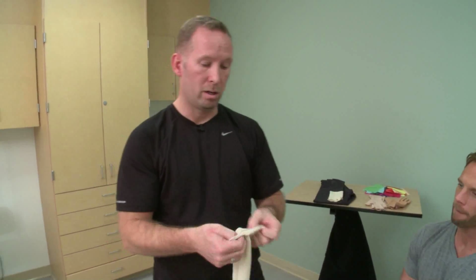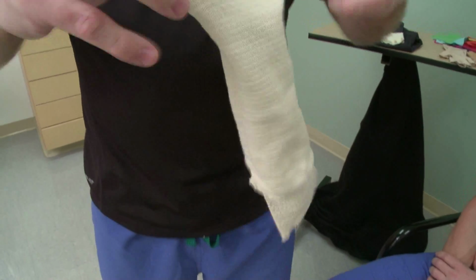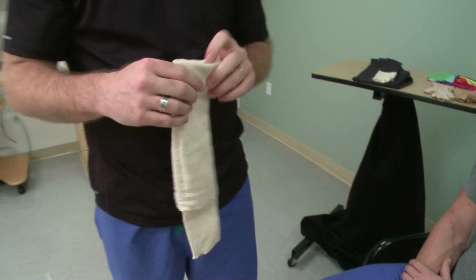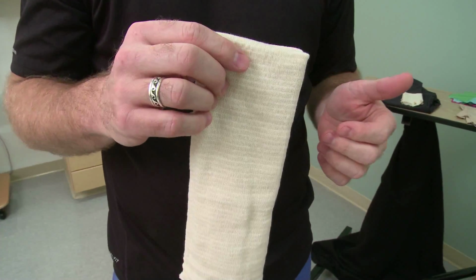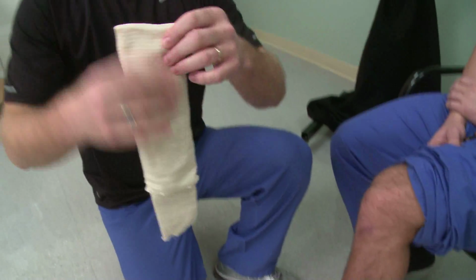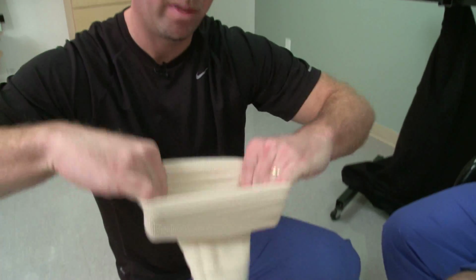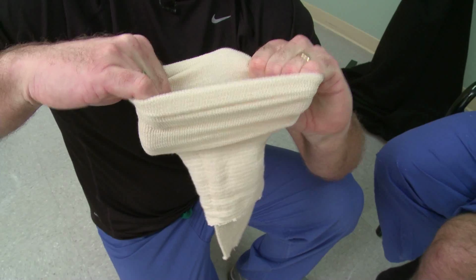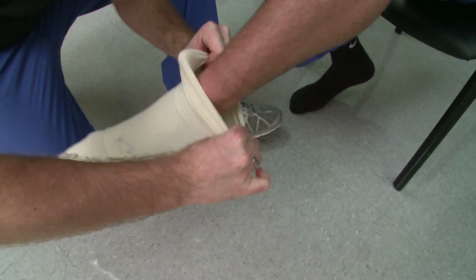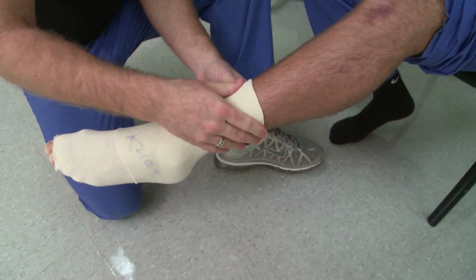It's important when putting this on that we protect the wound. The skin can be very fragile, and therefore we don't want to drag or slide the compression along the damaged area. As you can see, I folded it over onto itself and have it ready to put on with the correct manner to reduce injury to the skin. As I pull apart, I'm laying the compression down and preventing it from dragging.